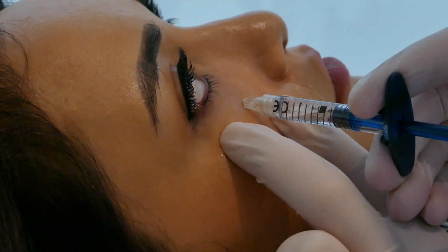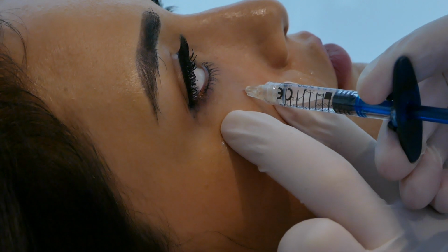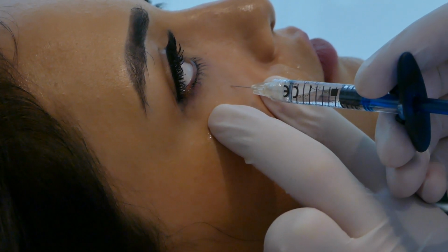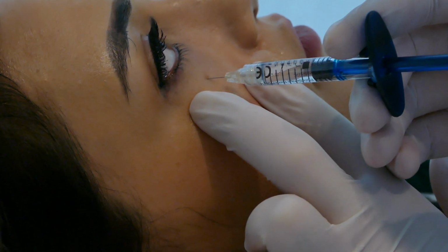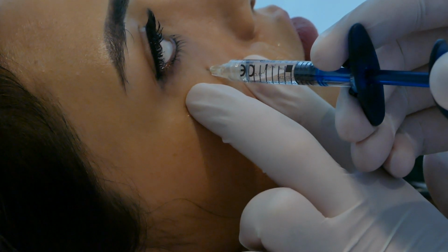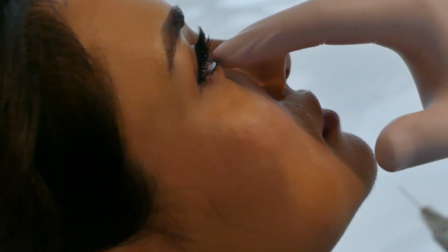You can see the maneuver of the needle where he is going up to the bone and slowly withdrawing it and then going above the periosteum to inject small aliquots of fillers. A very gentle movement and a very tiny injection prevents intravascular injection of fillers. After the placement of fillers, gently massage to spread the filler over the infraorbital rim.